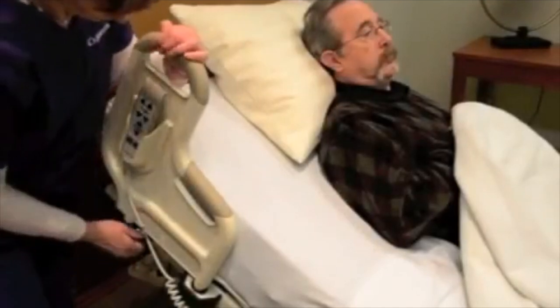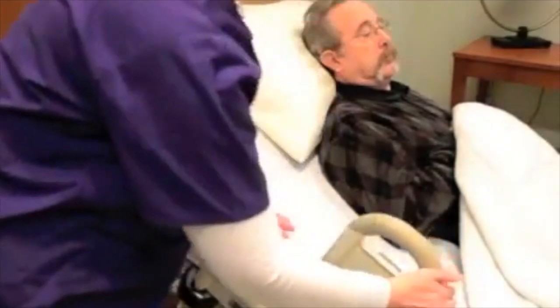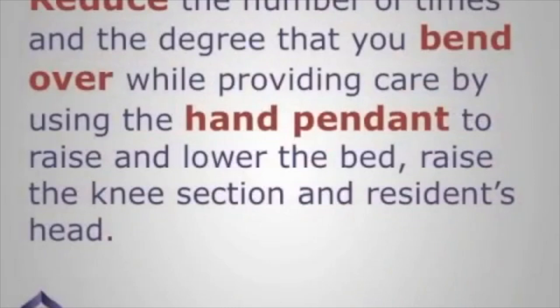When moving the assist handle, simply pull out the knob and rotate the handle from one position to the other. Using your hand, push hard on the bottom portion of the handle in order to securely lock it in place.